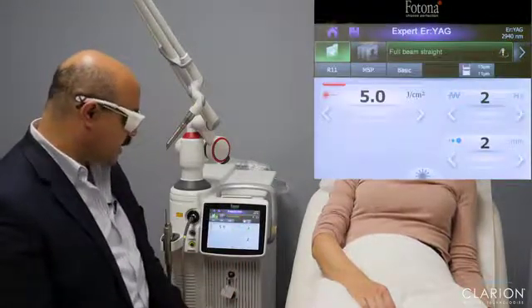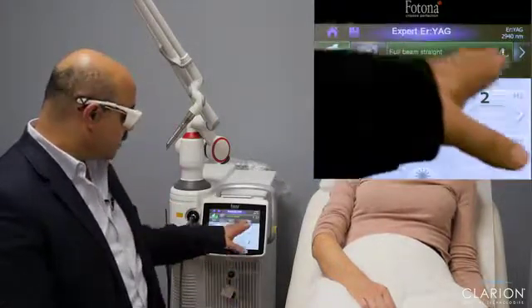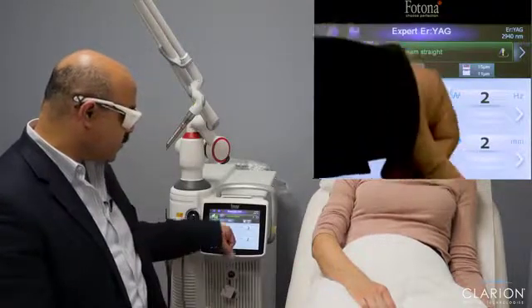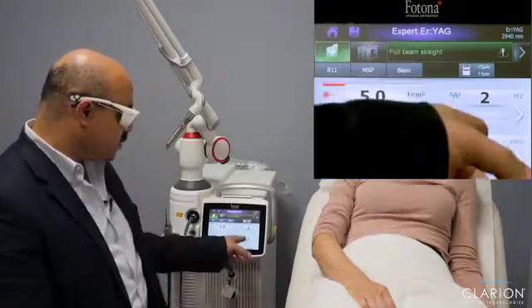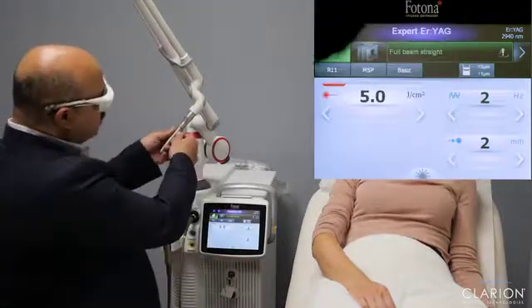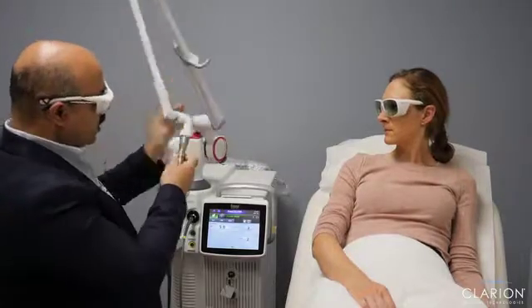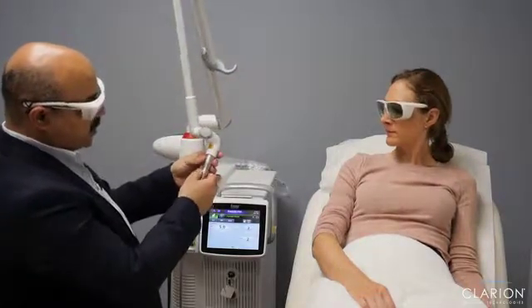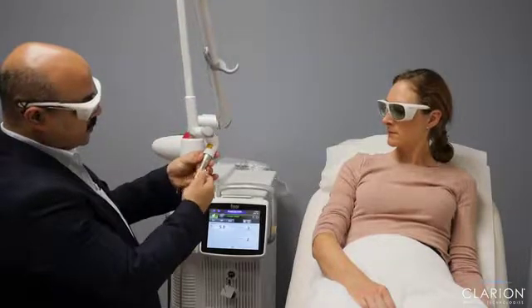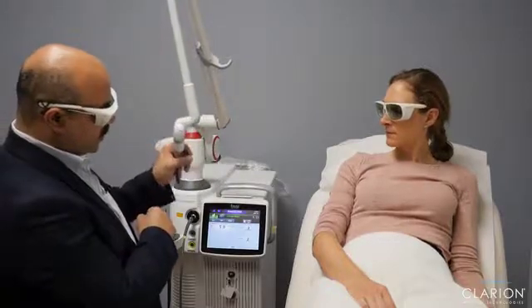So this is the ratio of ablation coagulation we would like to achieve, and those are the settings we are going to be using today. This was achieved with 5 joule per centimeter square with 2 mm spot with the R11 handpiece. We have to make sure that we adjust the spot size of the handpiece according to the adjustment on the screen. So we have to use the 2 mm spot. So now it is 2 mm and the machine is ready to go.